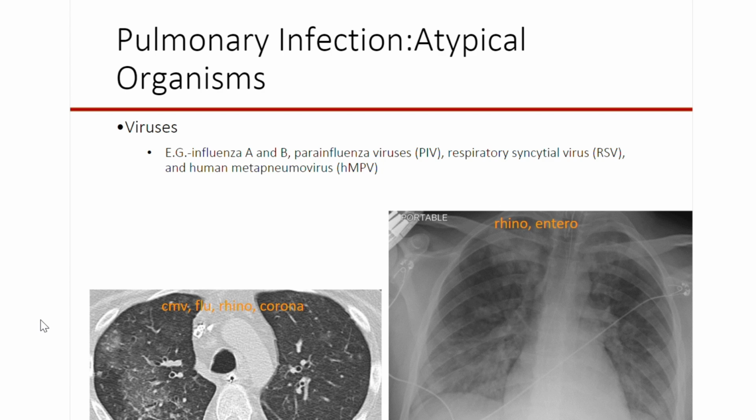I like this slide. I've been showing this through the pandemic, and I told you I have some amazing infectious disease colleagues who give me a wealth of organisms, and they said, hey, Lagasso, that ground glass that you said may be viruses, just wanted to tell you that there were 4 viruses.